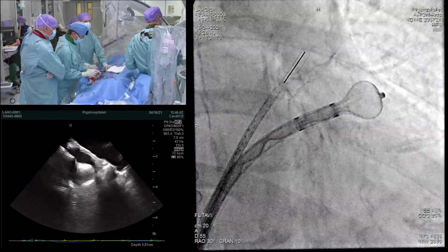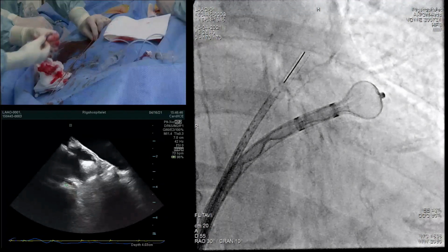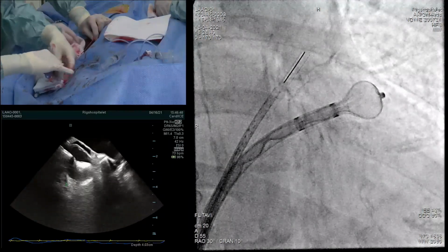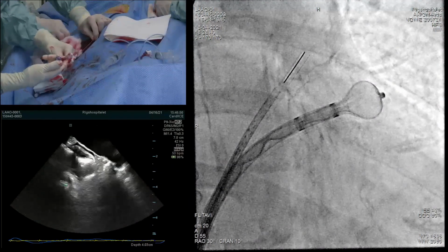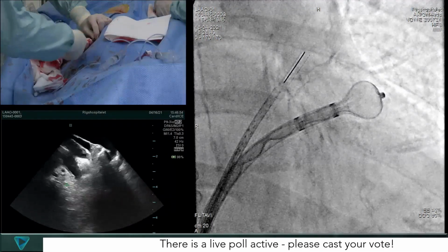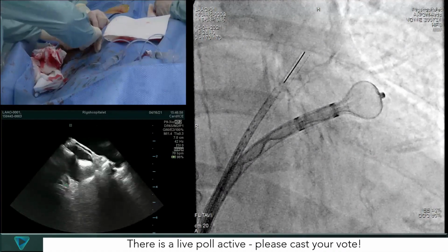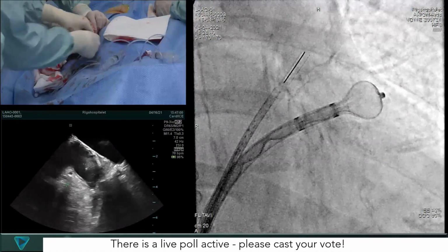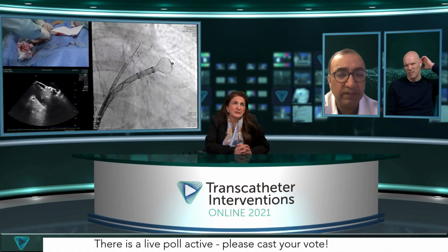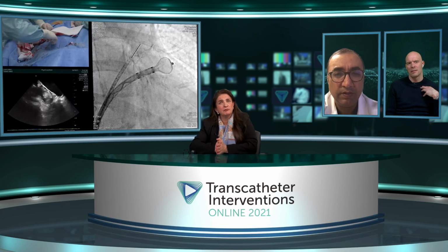So that's absolutely something to avoid: air in your catheter when you're working in the left atrium. If that happens, you really risk that air comes into a coronary artery and can provoke really large ST elevations on the ECG. Okay, let it still bleed out because it's not flushed here. Can I ask a question? You can easily get air into the left atrium, and then it goes into the right coronary artery. Exactly. So it's good to show how pedantic they're being about this. So you really have to be careful.